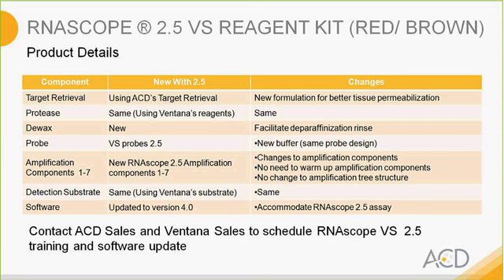The detection substrate remains the same. And lastly, the software is updated to version 4.0 to accommodate the RNAscope 2.5 assay. And please contact both ACD and Ventana sales to schedule an RNAscope VS 2.5 training and software update.